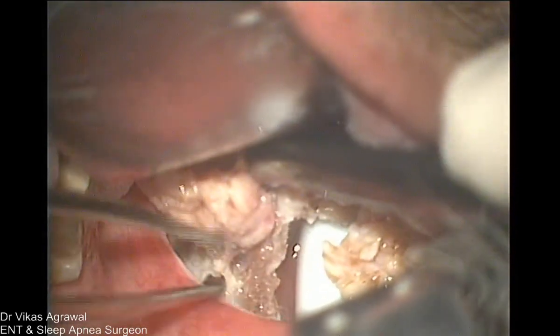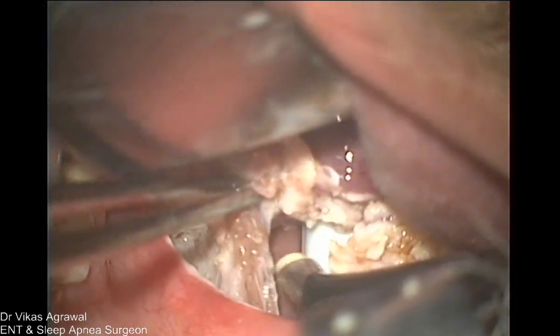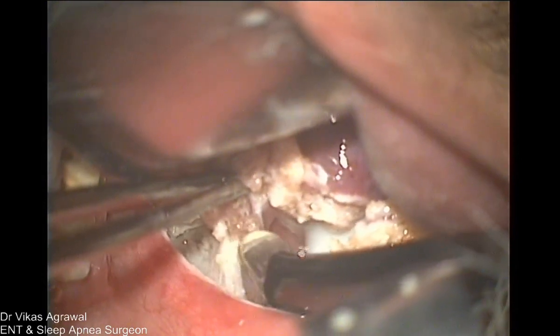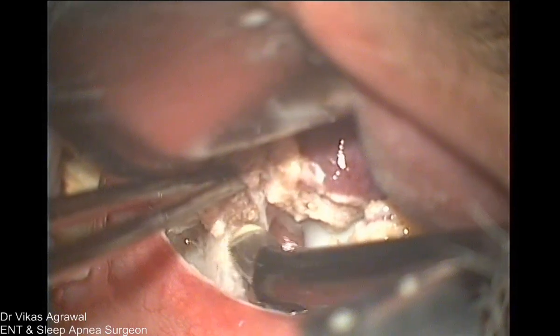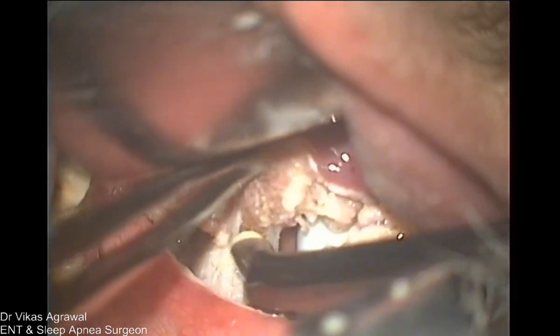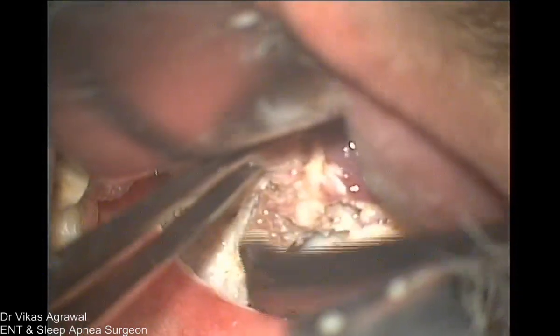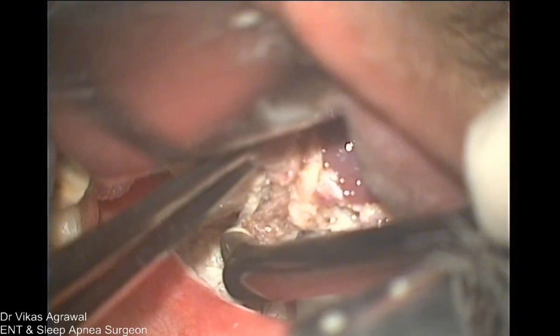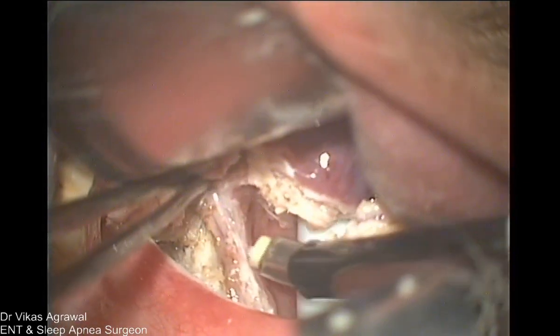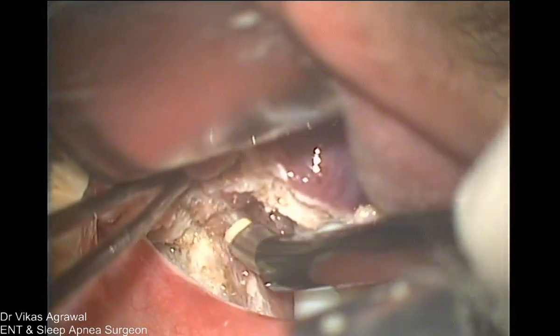So Kalpesh, how much time have we taken this time for the UPPP? 20 minutes, right? So this is our routine time. Generally 20 minutes is the routine time we take for UPPP, but obviously that time I was demonstrating everything, so it took a little longer. UPPP is not a very difficult surgery if you understand the principles and if you select the patients well.